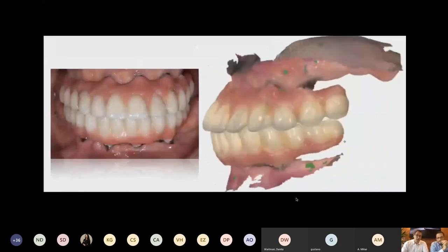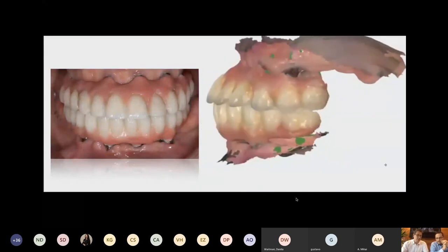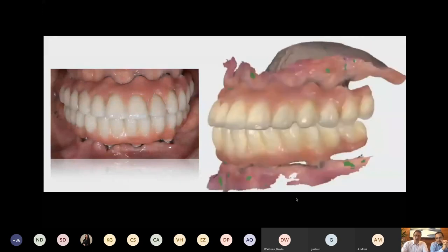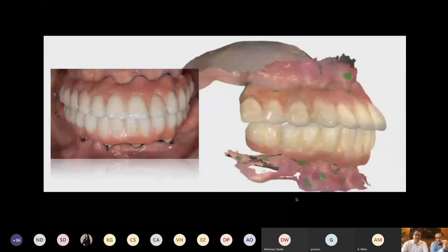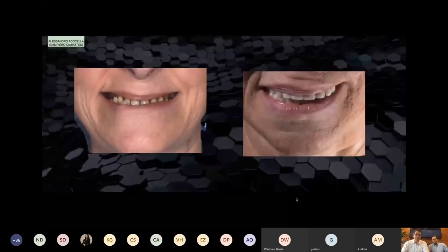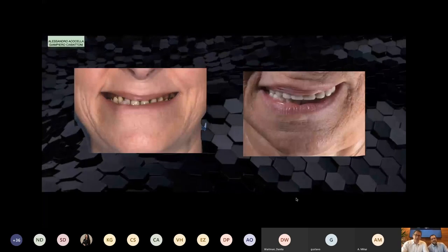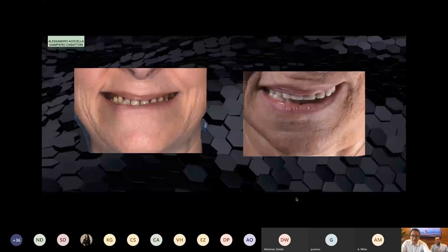And we love now to use the intraoral scanning to see like a photo, a three-dimensional photo, and to see over time how the tissue and the implant can have the healing. And a little bit also an increase of aesthetics. It's an old patient, but anyway, most of the time the patient is happy. She's happy.